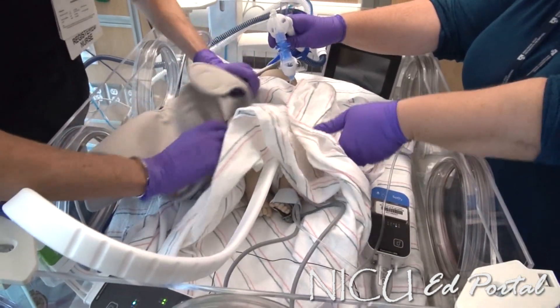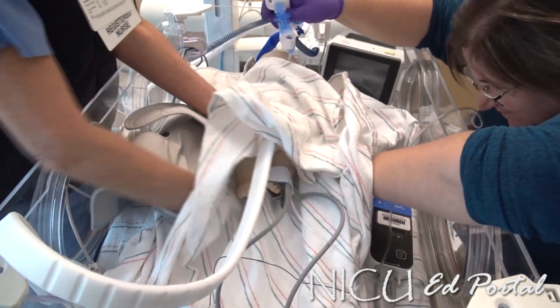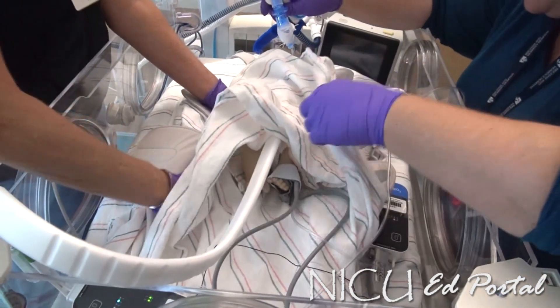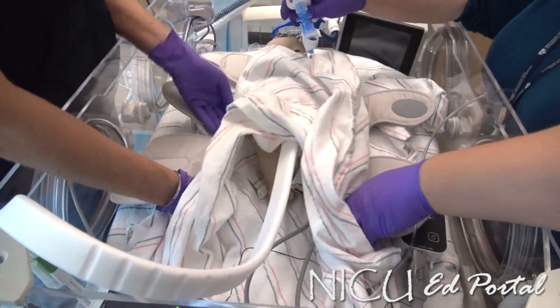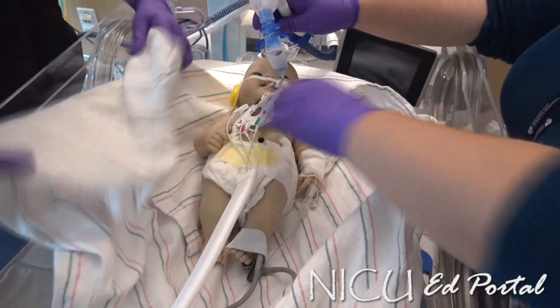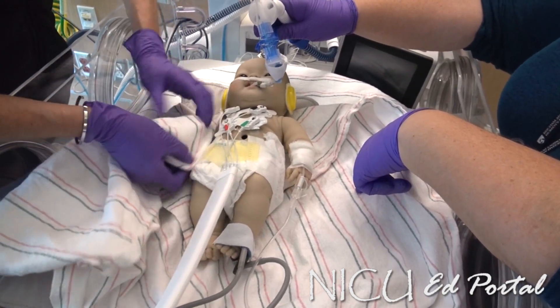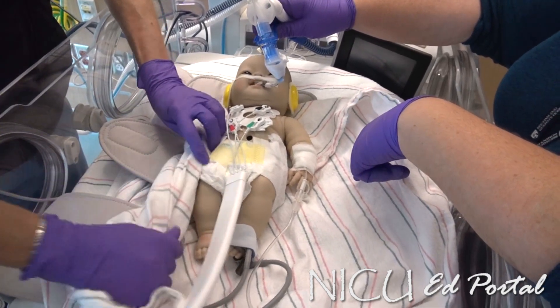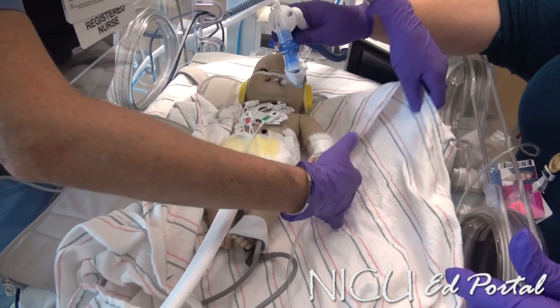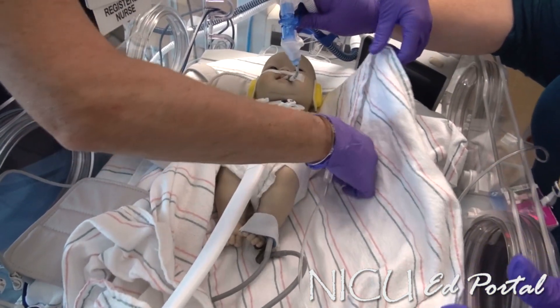I'll hold the tubing and pull the swaddle underneath. I'm coming underneath and lifting right now — there goes the swaddle in underneath. We need to move Patrick up a little so his head is in line with the very top of the swaddle. We want to keep the hands separated from the body, wrapping one arm down. The other arm has the IV — make sure your IV looks good before you wrap him up, because once he goes in the machine you won't be able to check it for an hour. That's infusing beautifully with no sign of infiltration.